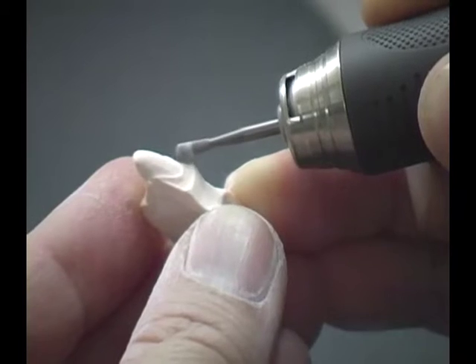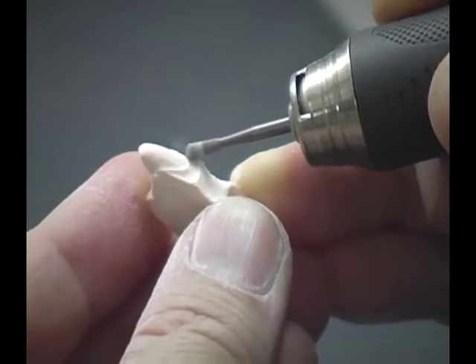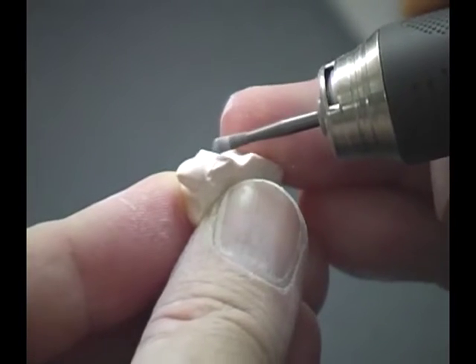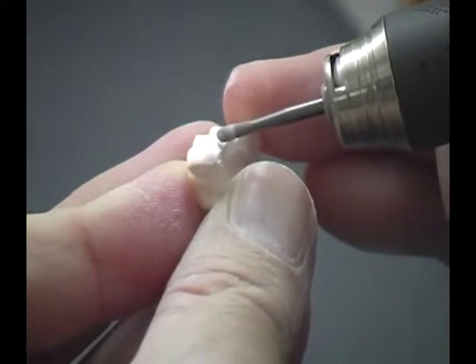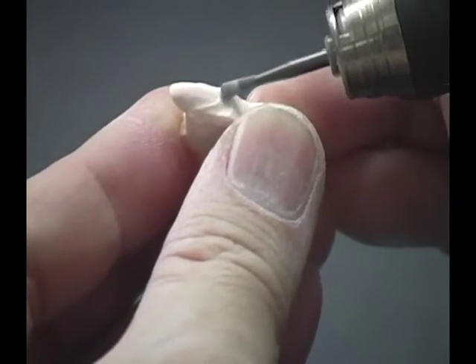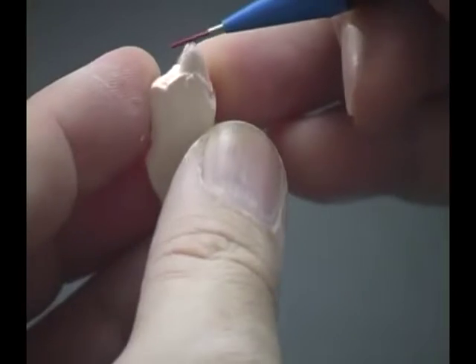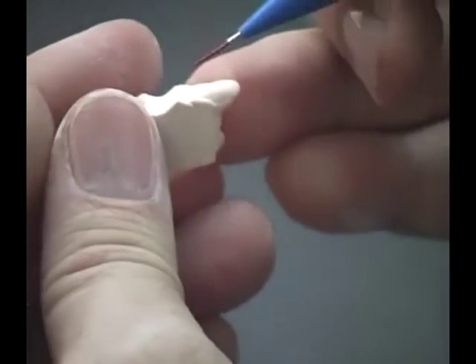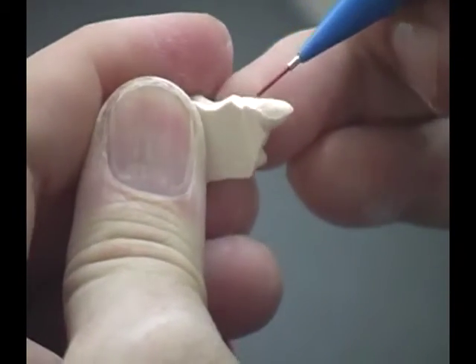Prepare the die with a round burr to expose the margin area and ensure not to cut the margin. Then outline the build-up area and mark the margin with a red color pencil.